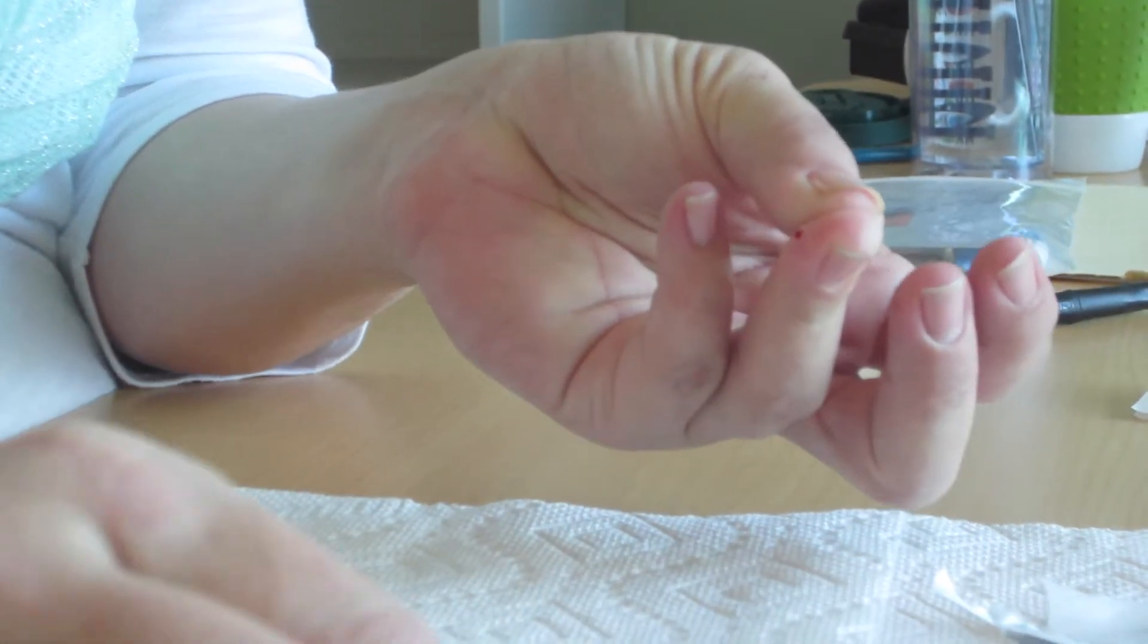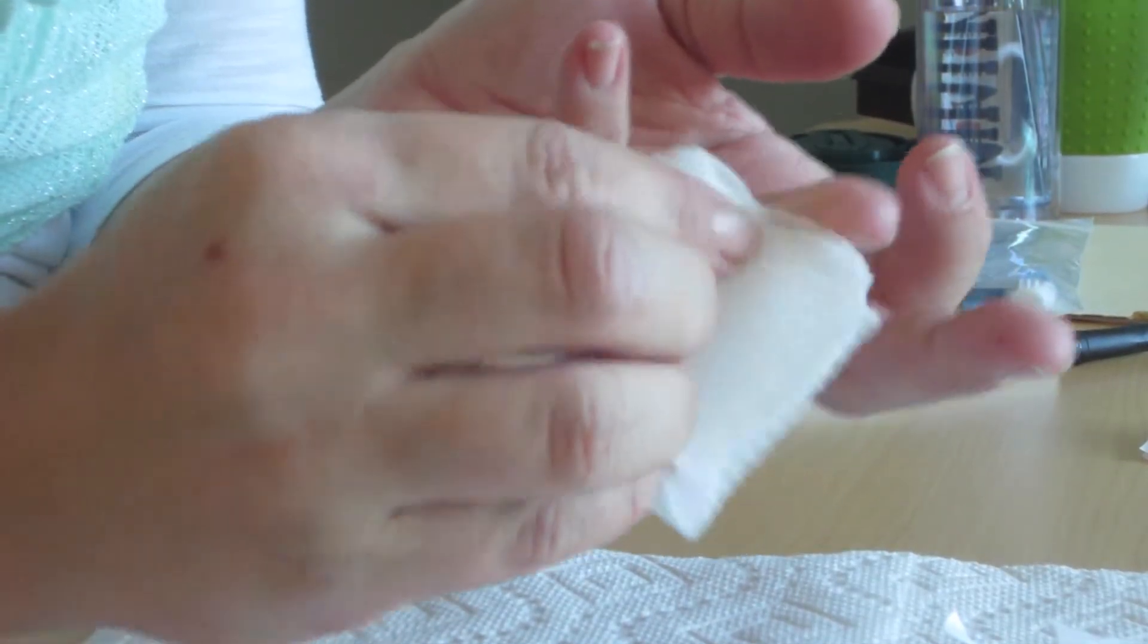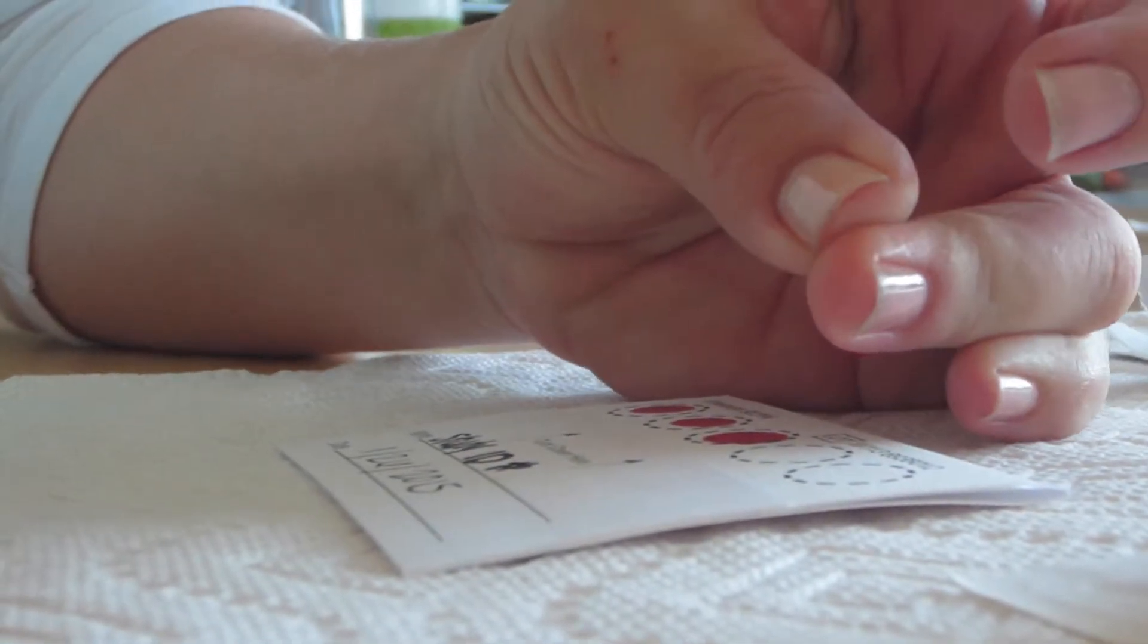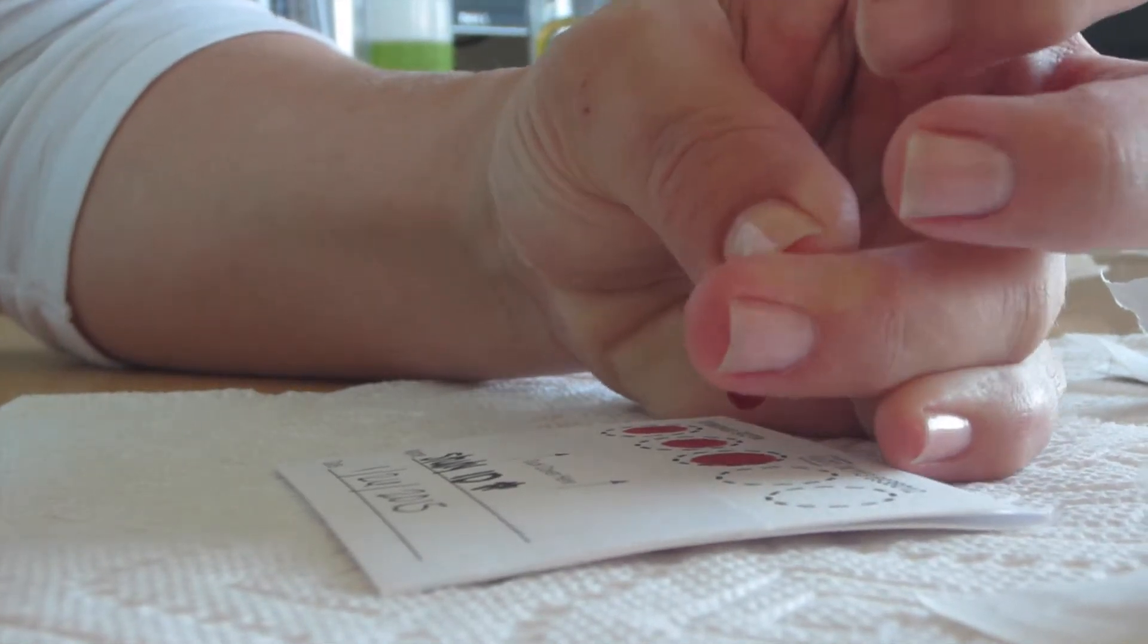Use a gauze pad to wipe away the first drop of blood. Milk the finger to ensure good blood flow. In order to milk the finger, place your thumb at the bottom of the chosen finger, gently press down and slide your thumb up the finger pad.